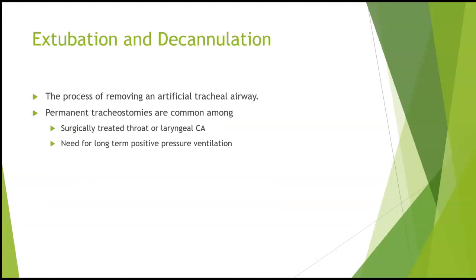Okay. So moving into extubation and decannulation. So this is meaning we're doing this on purpose. Our patient just didn't take things out on their own. This is a process for removing that artificial airway.